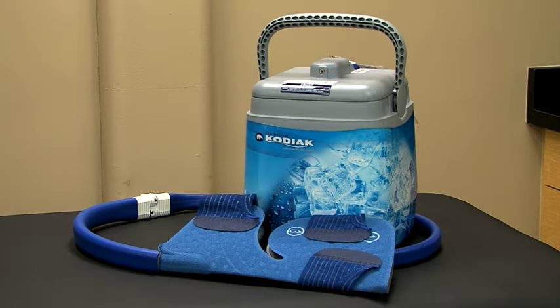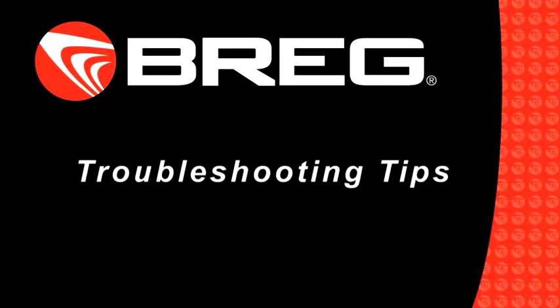Breg's PolarCare units are very reliable. With proper setup and maintenance, our customers experience very few difficulties. In the event you run into an issue, let's go over a few tips.